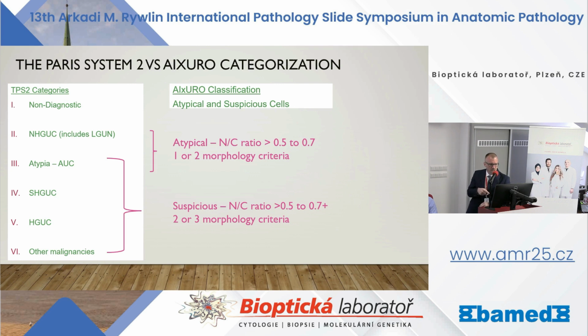But right now there are debates that 0.7 is too much, that we should lower the threshold to 0.65. And for me, I don't know any human that just with their eyes can see the difference between 2 cells that are 0.65 NC ratio and 0.7. Nobody can. I think even 0.6 to 0.7 is for the human eye impossible.